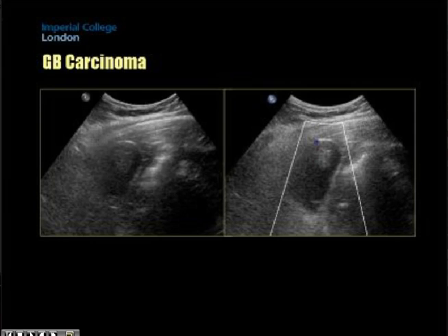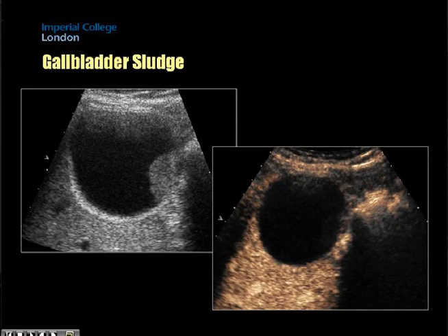As you can see here in the arterial phase, the mass enhances quite vividly. And then you compare it with the adjacent liver parenchyma in the portal phase, you don't really see as much rapid washout as you would expect for a malignant tumor. But if you wait long enough, you'll see some of the washout in the late phase, and there's still a lot of contrast uptake compared to the adjacent liver parenchyma.